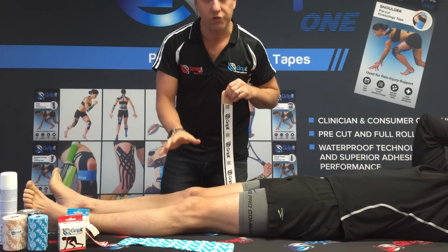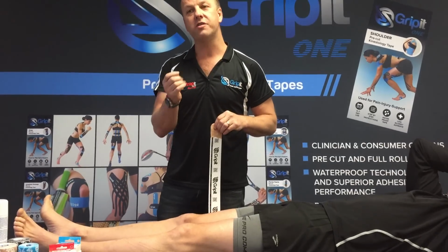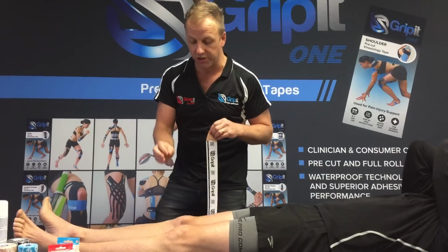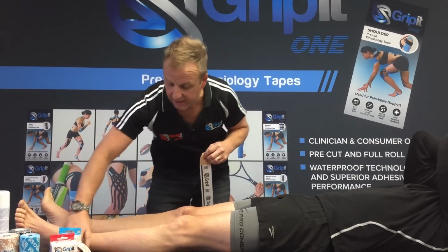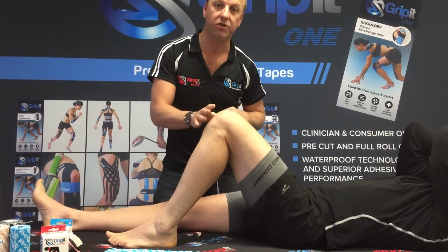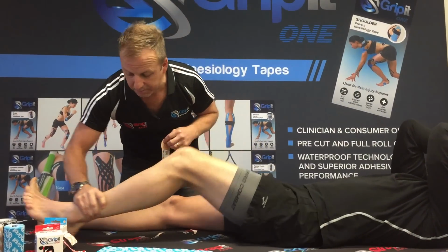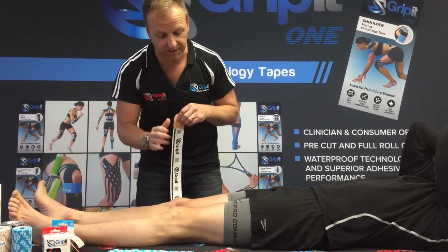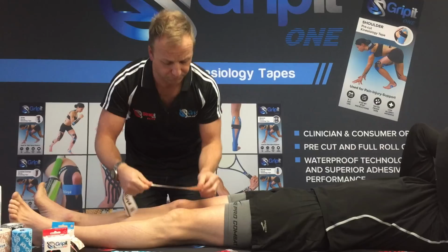Now, important is your starting position. If you're used to the traditional kinesiology method, you would normally have the joint in a lengthened position. So for the knee, that would normally be in a flexed 90-degree position. But with the active tape, we actually start the limb in a shortened position. So it's very important. There's a big difference there because we're trying to unload the joint.